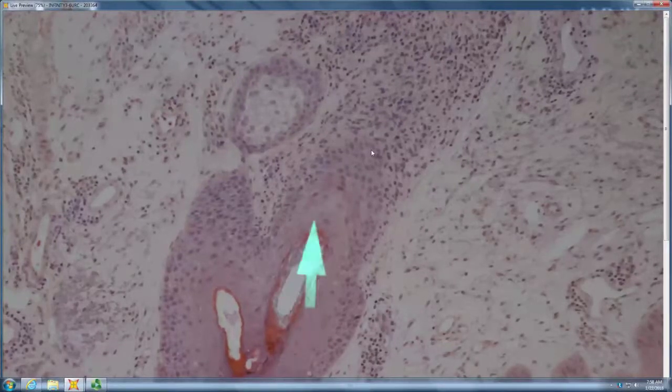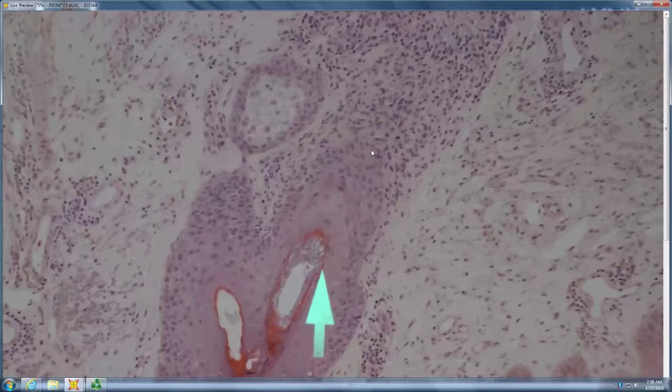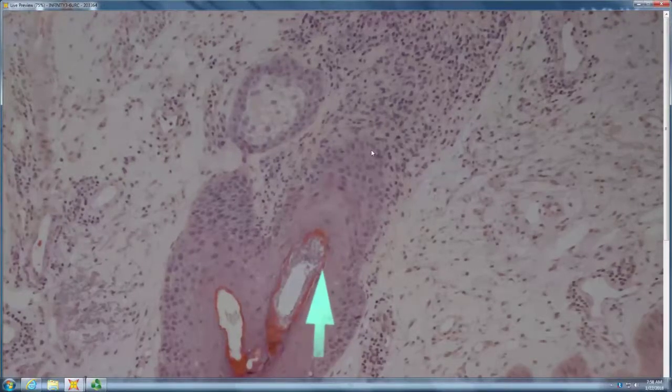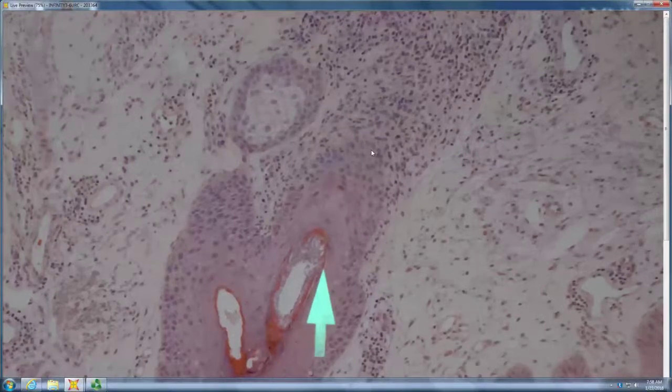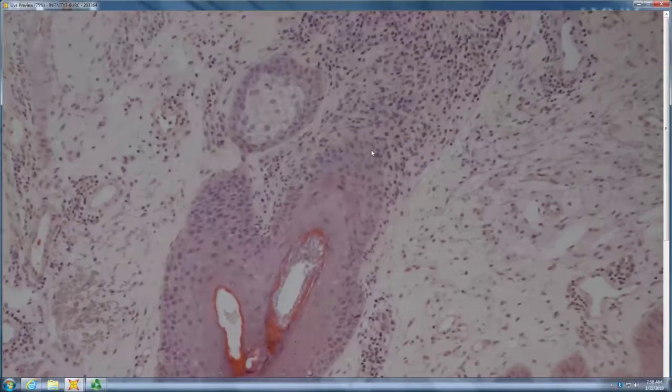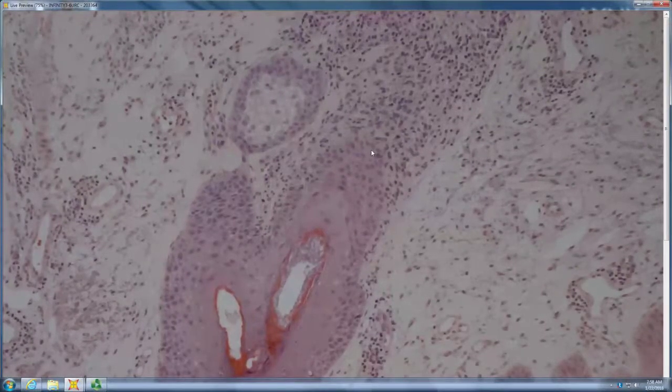And so, probably a tinea faciei with Majocchi's folliculitis. So, quote, Majocchi's granuloma, there's usually no granuloma. It's usually just fungal folliculitis. So Majocchi's fungal folliculitis, you can see some neutrophils here. It's a neutrophilic suppurative folliculitis from the fungus. Common where topical steroids have been used or under occlusion.